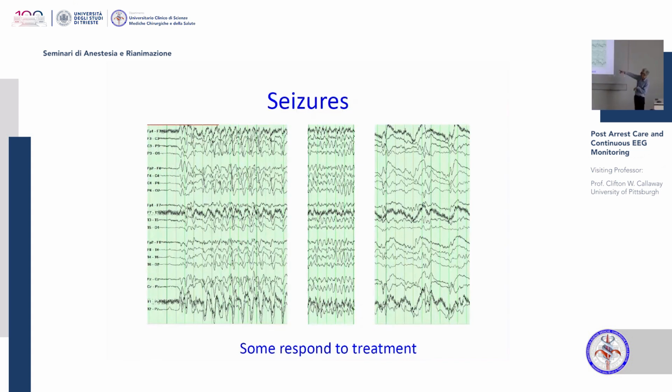You can see clearly here, that one speeds up, and then it changes, and then it stops. So it may stop because of time. Seizure just stops. It may stop because you give a drug, but it evolves over time, and that's a seizure. Now, not all seizures have jerking, right? You can have non-convulsive seizures. And many patients after cardiac arrest will have these electrographic seizures, but they'll look unconscious, they'll look flaccid. Again, without your electrical monitor, you don't know. You don't know if this is happening.